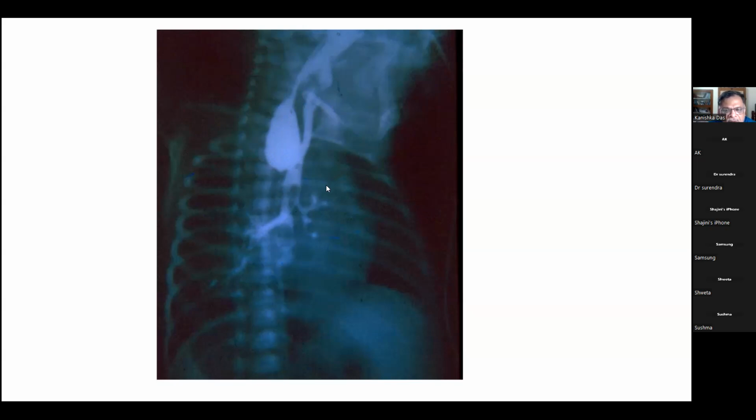So if you say all this, and then you say the rest of what is seen is normal, then the examiner will go on to ask you questions. So why do you think this is an upper pouch fistula, like you are saying? You said this looks like a fistula, isn't it? Upper pouch fistula, somewhere there. Why do you think, sir, this is a fistula?